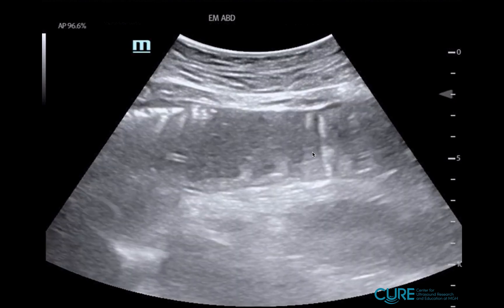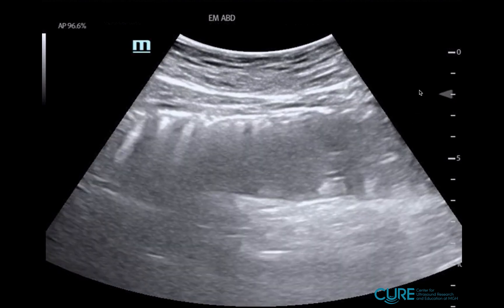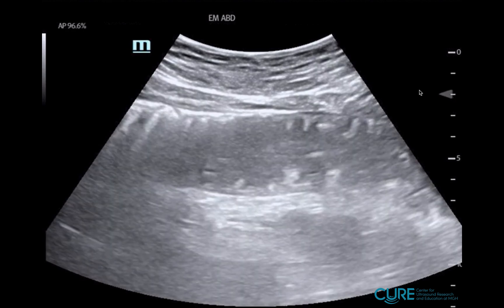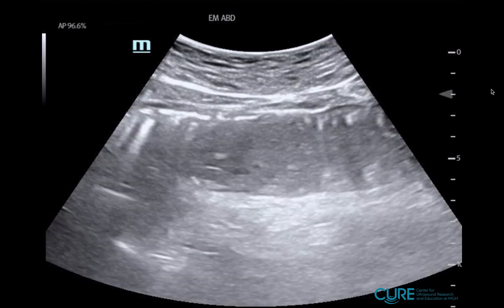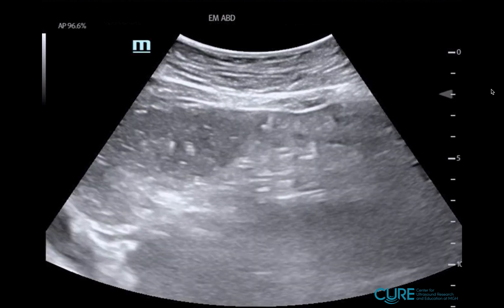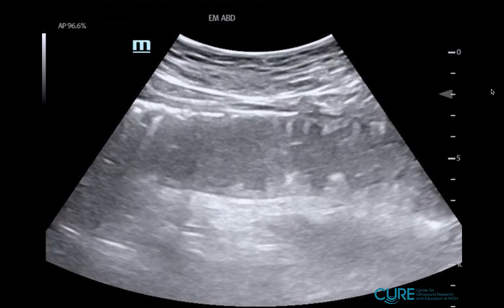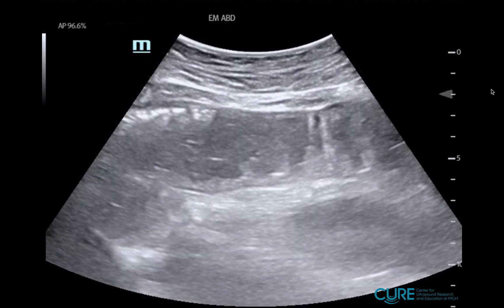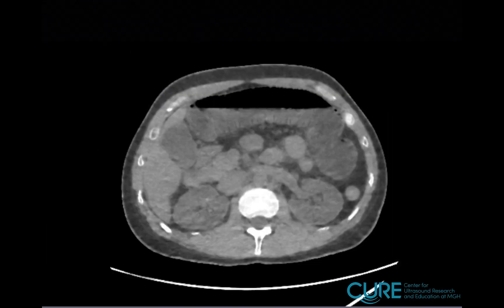You can see that going all the way across. What else are you seeing here? We see this to-and-fro movement of the bowel content, something we call pendulous peristalsis. It makes me think that there is something blocking the forward flow of the contents — all the bowel is going down, hits some sort of roadblock, and turns around. So at this point, we were concerned for a small bowel obstruction. We placed an NG tube, called general surgery, and they wanted us to obtain a CAT scan, which confirmed our findings. Here we see those dilated loops of bowel and the air-fluid level.